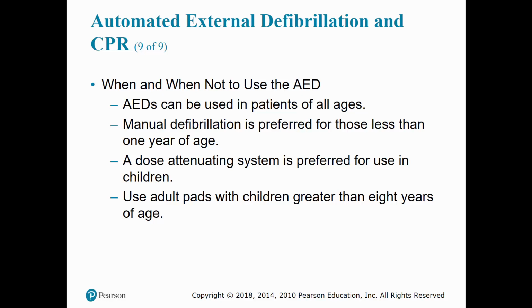All right, children 1 to 8: when we first started dealing with AEDs, they tried to have pediatric pads and adult pads inside of the AEDs. Now, more so, you don't see the pediatric pads. Most defibrillators are pretty smart, and even with children 1 to 8, you can still use the adult pads. So don't think that because you don't see pediatric pads inside of an AED you can't use it. You can still use it on children 1 to 8.